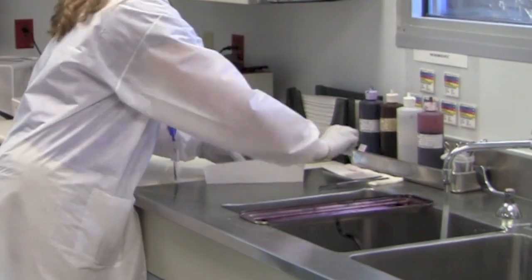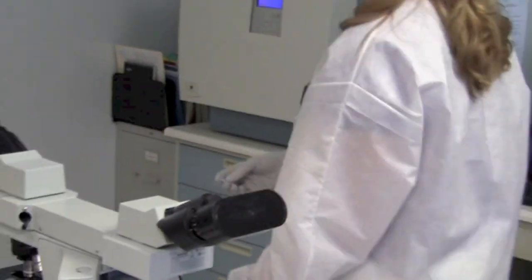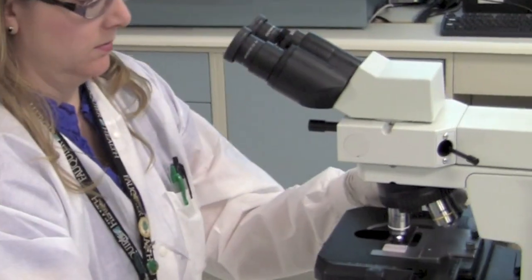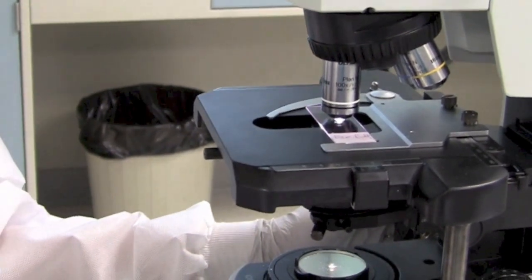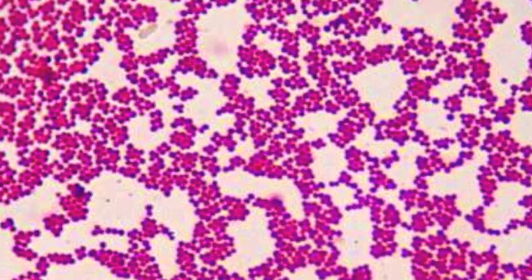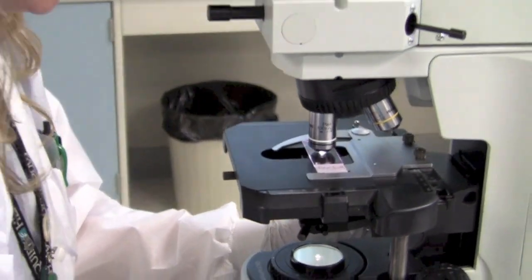Once the slides have been air dried, the slides are then examined under the microscope to visualize any germs present and classified as either gram-positive or gram-negative. In this case, gram-positive cocci are identified that resemble Staphylococcus. However, to determine whether MRSA is present or not takes more testing.